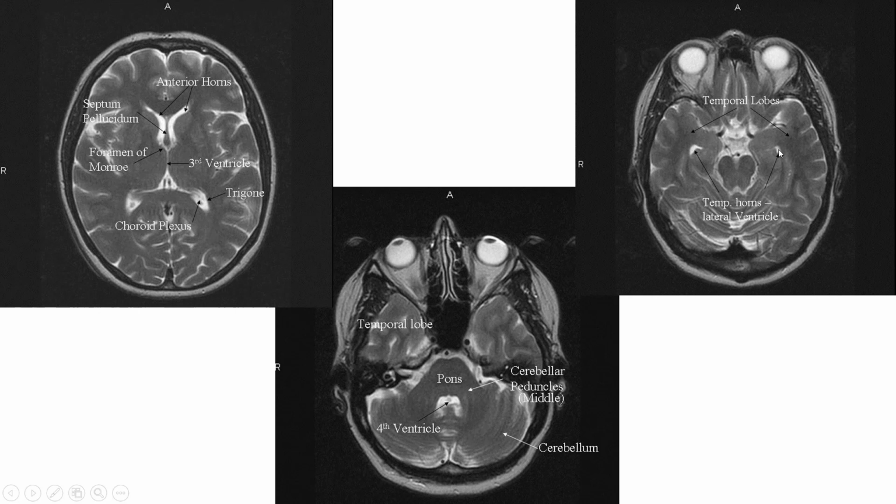And you can see how sometimes you just clip a little bit of the image and you're not able to see the full temporal horn. Partly that is also because it is moving inferior and anterior as well as laterally, so it would be hard to catch it unless you were angling specifically to see the temporal horns.